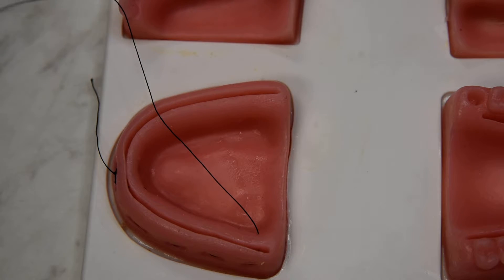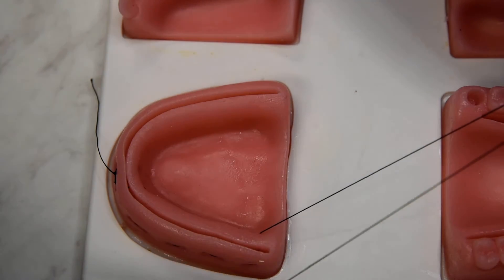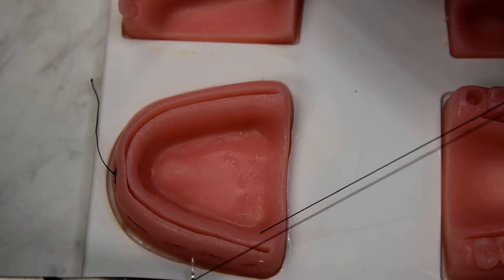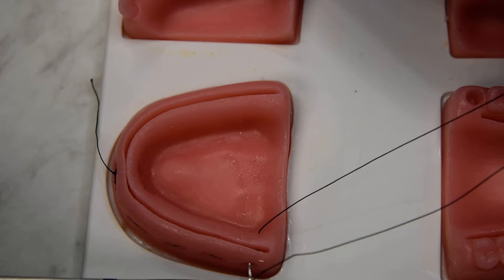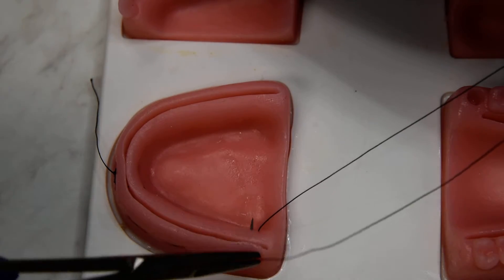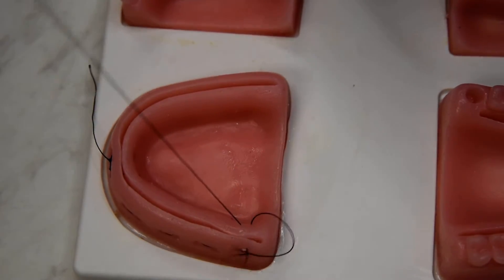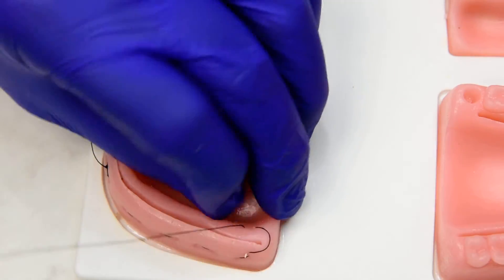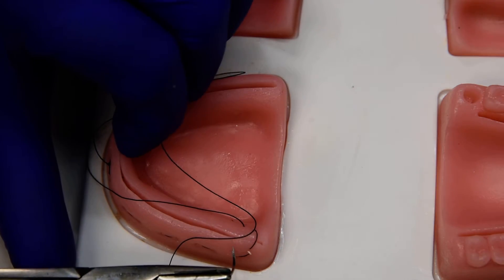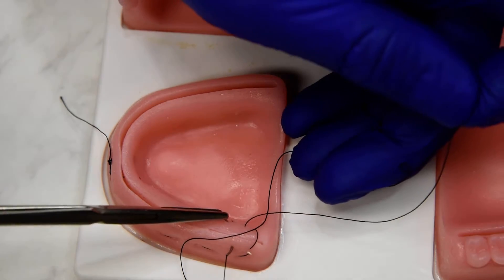And now we're going to walk back forwards towards the midline with a simple continuous, being mindful to not go apical of your mattress loops. We're going to stay coronal or marginal to the mattress loops and we'll do a simple continuous, just walking our way back all the way back to the midline.